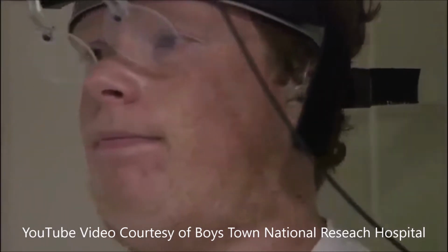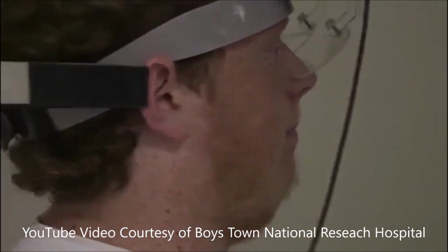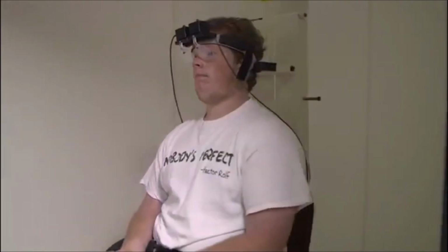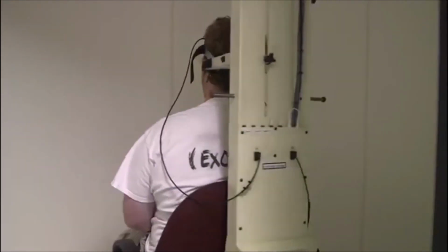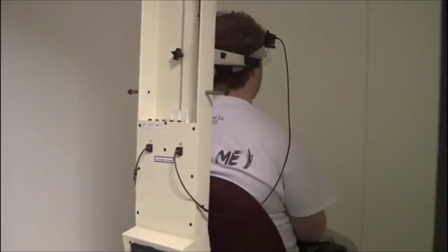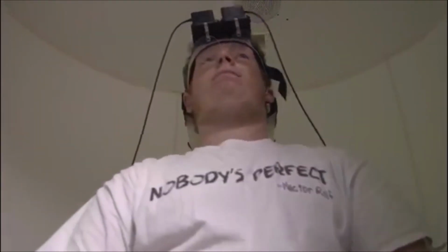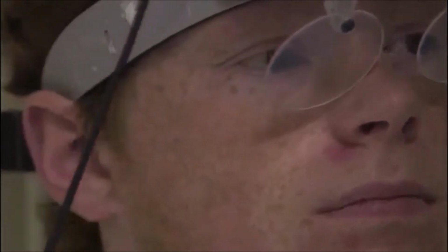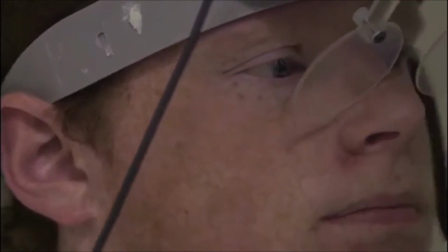And remember that headset you're wearing? You can communicate with the audiologist throughout the entire test. During the test, the audiologist will change the way in which the chair is moving from right to left to get a full look at your horizontal canals and how they're functioning. Sometimes you'll feel like the chair is moving, and other times you'll feel like it's staying still. That's completely normal. The audiologist will also be asking you questions or giving you a task to complete, like counting backwards from 100 by threes, or naming all the states that start with the letter A. Don't worry, you're not being graded. This is just to keep your mind busy throughout the test.